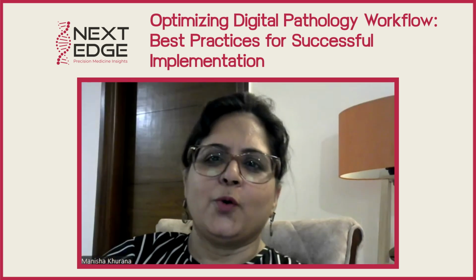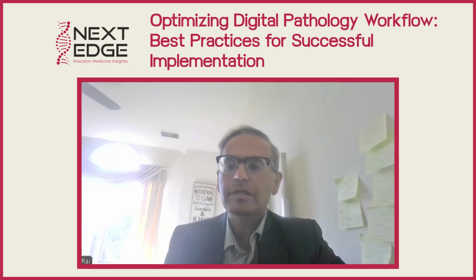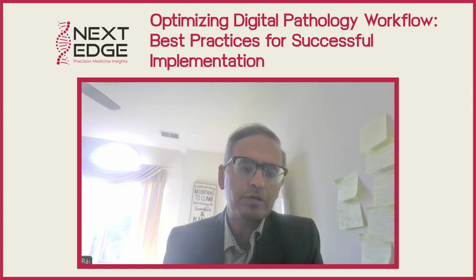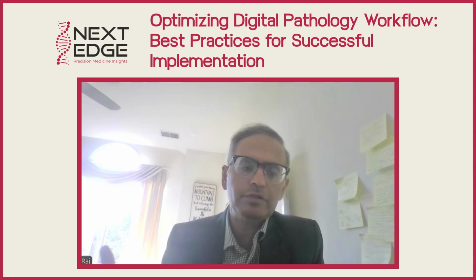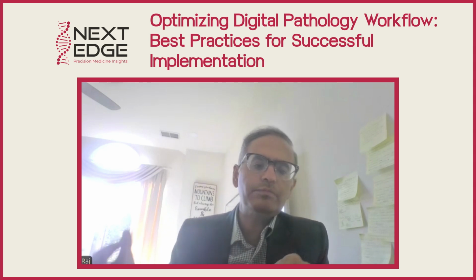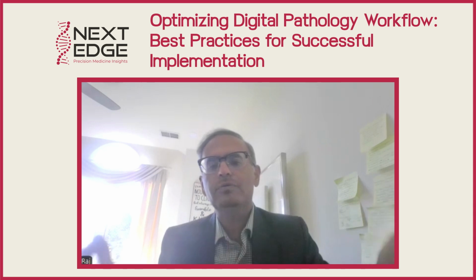Correct. So, what are the critical factors to consider when selecting a digital pathology platform or a vendor? There are many different aspects that come in when you want to select a digital pathology vendor. The first important aspect is what is the use case? Are you going to use it for making a primary diagnosis? Are you going to use it for consultation services that you're going to provide? Are you going to use it to share your data with AI companies and with pharma companies or with researchers to use the data? Are you going to use it for education? So there are very different use cases that can happen. Or are you going to use it for everything?